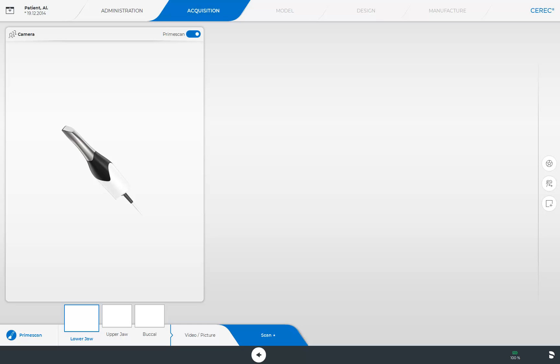We have already set up our patient and the indication. We are now in the acquisition phase. The default image catalogs — lower jaw, upper jaw, and buccal — are displayed at the lower edge of the screen. A Full Arch Scan can be performed with just three sweeps, and we are going to start with a scan of the lower jaw.